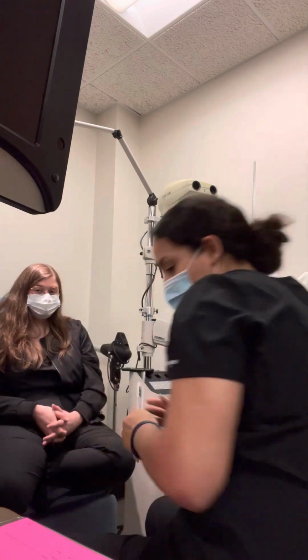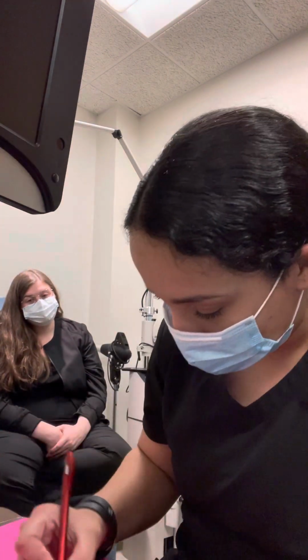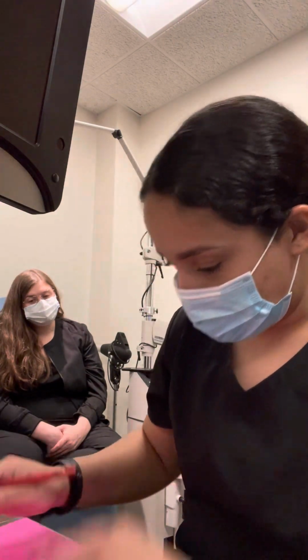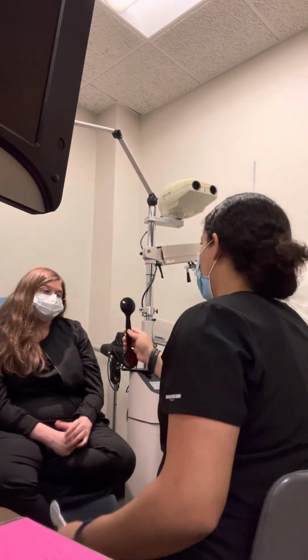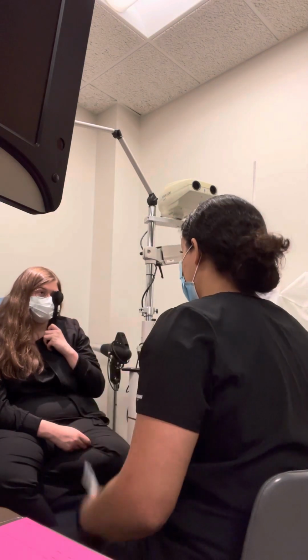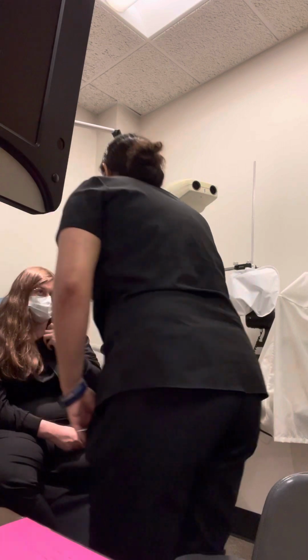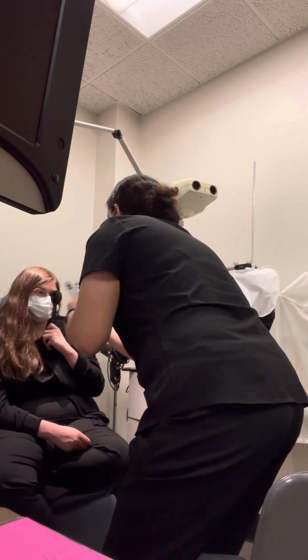Okay. Alrighty, for near point of convergence, she has a 9 centimeter break average and a 12 centimeter recovery. Okay, alrighty, Mrs. Barber, go ahead and cover up your left eye for me. Next, we're going to be checking how well your eyes adjust to something that's coming up close in both your eyes, okay? Just let me know when it gets blurry. Go ahead and stare at the small V right here and just let me know when it gets blurry.